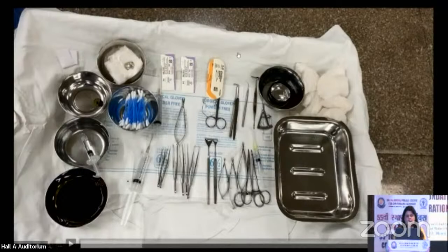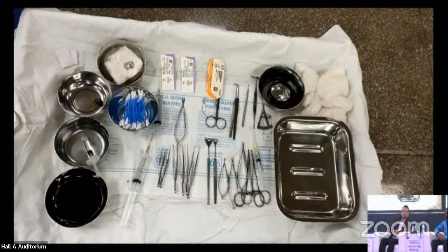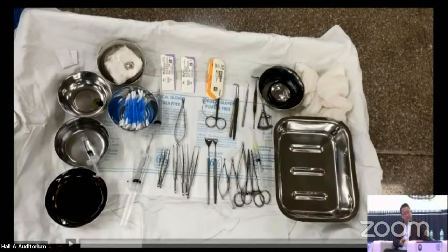And just a little word about the sutures that we use over here. We have the Ethibond suture and the Vicryl sutures here for different stages of the surgery. So Dr. Lomi, would you like to add something to the things that we need to keep ready for the surgery? Yes, one more thing which is very important, like the dummy plaque, which is kept pre-ready: the active plaque also has to be sterilized at the same time, so that when we are in a position to place the active plaque, we don't have to wait for it to get sterilized and autoclaved. Everything has to be pre-planned and properly sterilized. Yeah, that's a very important point. The rest of the things are basically what we use routinely during eye surgery.